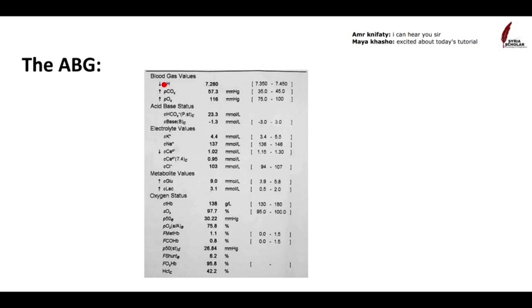The main things that you can find are to do with what we call the acid-base status, so the pH and the bicarbonate status, so that's acid-base. The other things that are useful are the levels of respiratory gases, so the oxygen and the carbon dioxide. And in addition to that, there's also very useful information about the potassium and sodium and calcium levels and the patient's glucose, which is very important because it's easy to miss that if you're concentrating on other things. And again, it's something that's very easy to correct very rapidly.